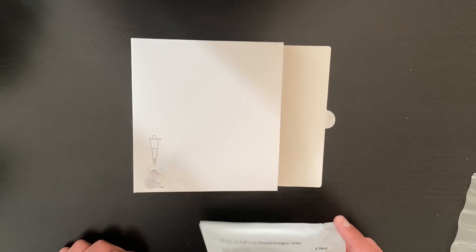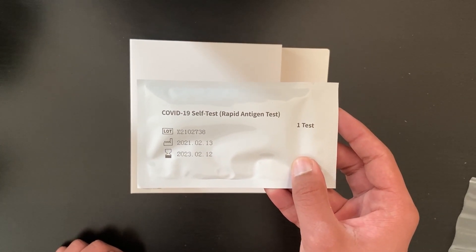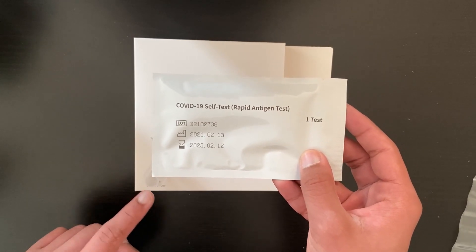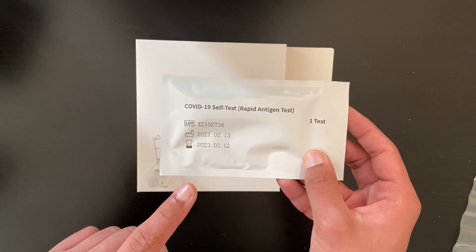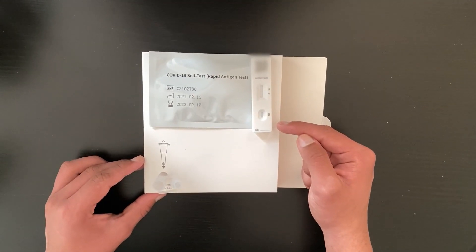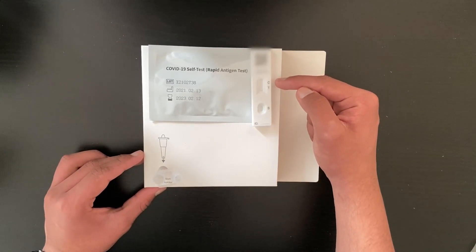The next thing we need to do is open the sealed test strip. Be warned that once you open this, you only have 30 minutes in order to put the buffer solution on the test strip, so you should be very quick. This is the test strip itself — this is where you pour the solution in, this is where you look for the results, and this is the barcode you need to use when submitting your results.